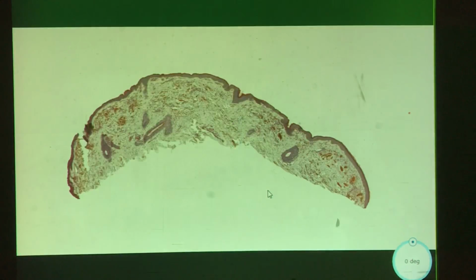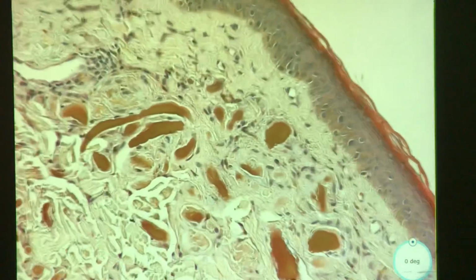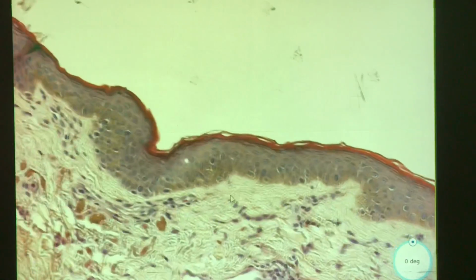Okay, so moving on to case 7. So this is, oh, okay, it's like a very widespread, ill-defined area of melanocytic lesion. Looks slightly raised, but it's like unevenly so. Our skin, epidermis looks pretty good at low power.